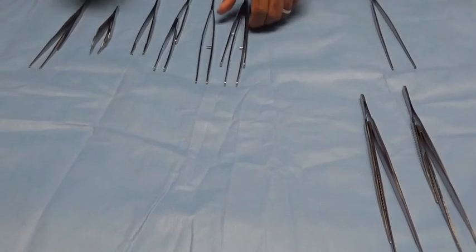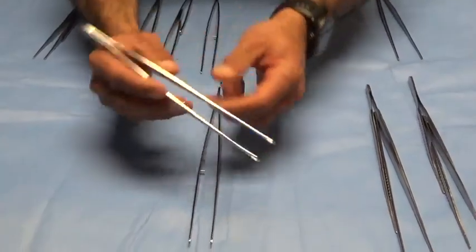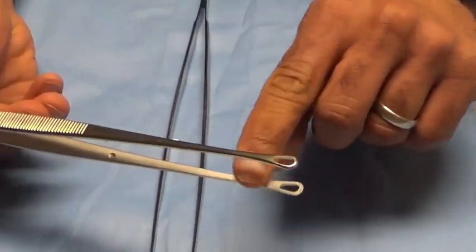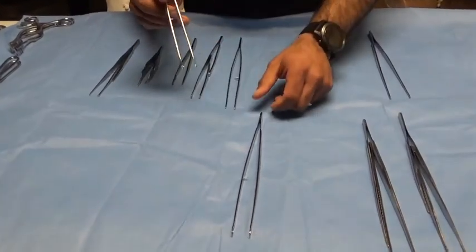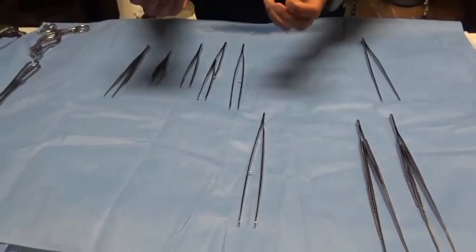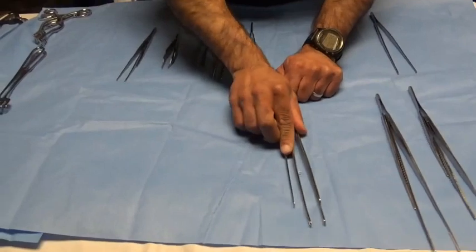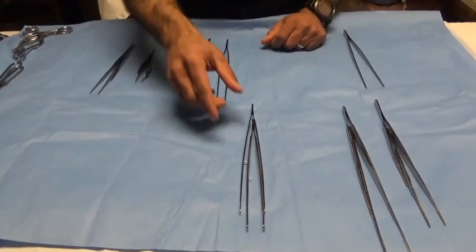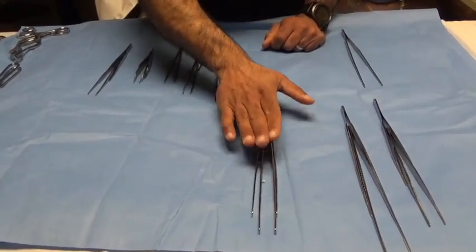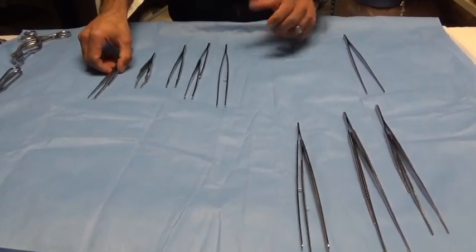Moving on to another forceps used viscerally: Singley forceps. Notice the Singley forceps are looped at the end — these are also atraumatic forceps. Culturally speaking, at our facility these don't get used very much, but at other places I've rotated they are the primary forceps when handling bowel and constructing anastomoses. Some of it is a function of who trains whom and what culture and tradition you bring from different training programs, but Singley forceps are generally used for bowel handling.